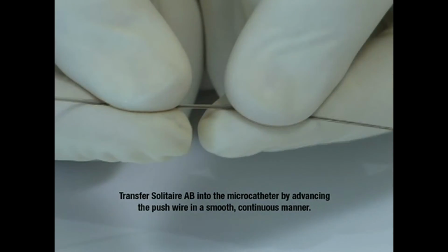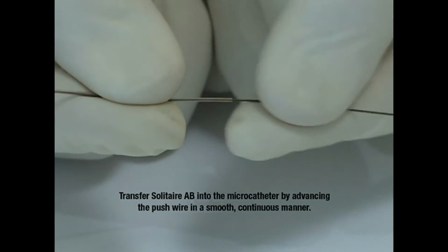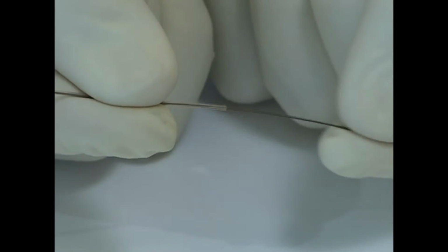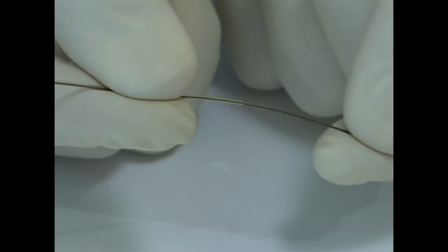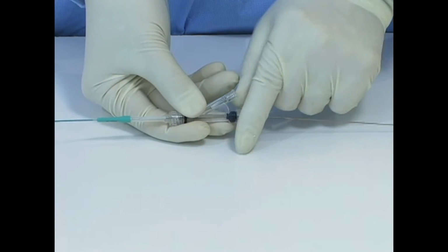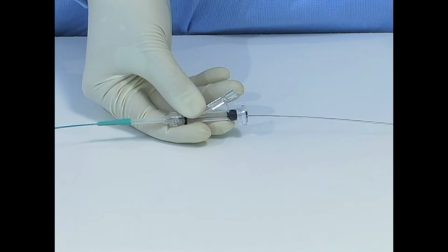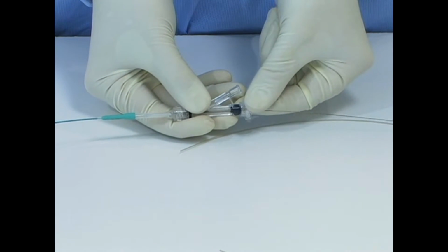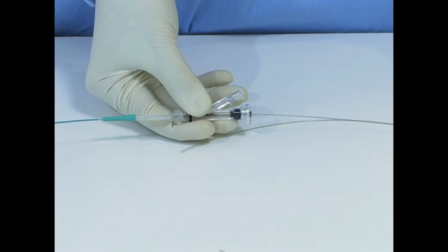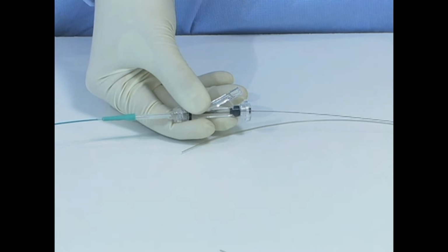Transfer the Solitaire AB into the microcatheter by advancing the push wire in a smooth, continuous manner. Once the flexible portion of the push wire has entered the microcatheter shaft, loosen the RHV and remove the introducer sheath over the proximal end of the push wire. Once completed, tighten the RHV around the push wire. Visually verify that the flushing solution is infusing normally.